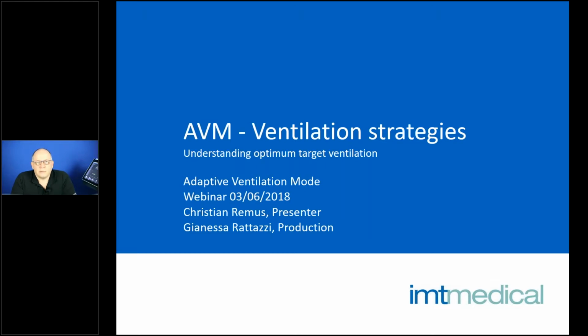Today is the second part. 14 days ago, we had the first part with the basics of AVM and how AVM is called, what it means, and what is closed-loop ventilation. Today we go one step ahead and talk about the application of AVM and also about the strategy, how and when to use AVM. And let's start right away.